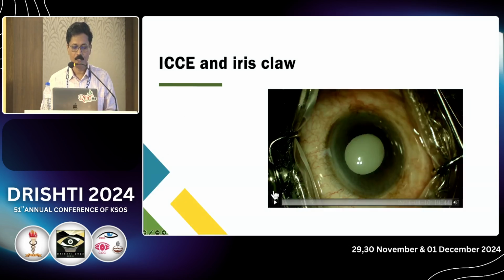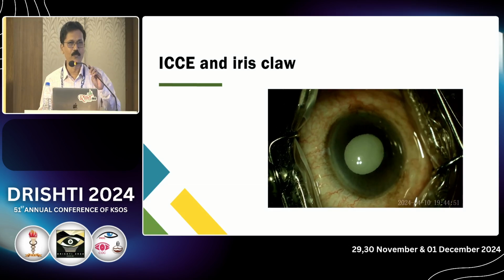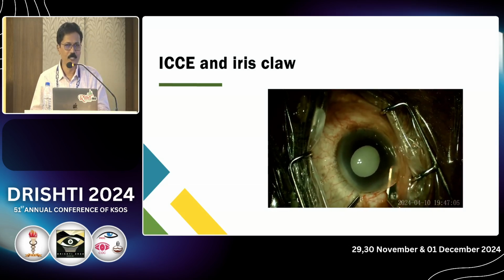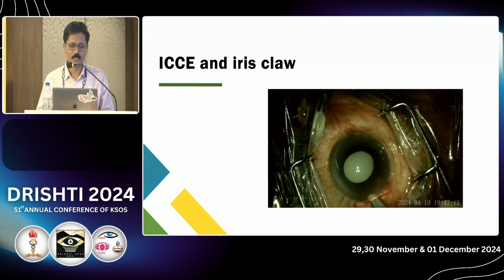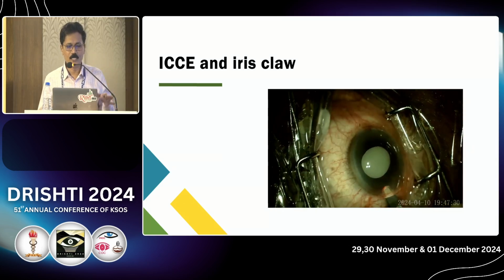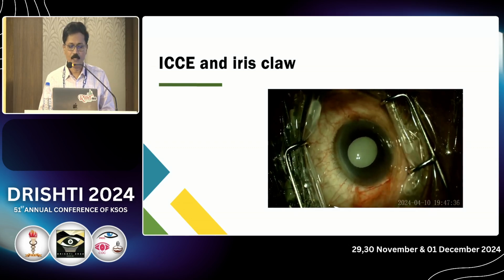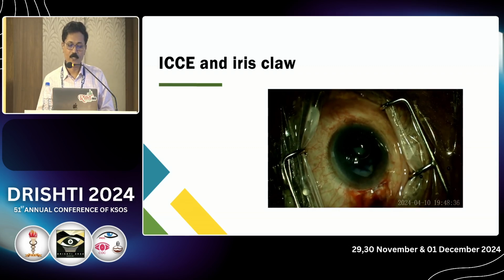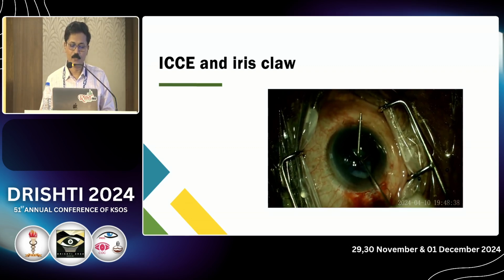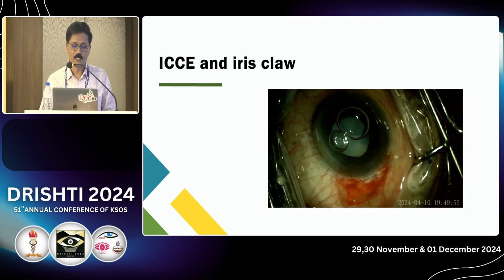Then in some cases, I think you should be prudent not to do phaco, because you cannot do phaco in all cases. In this case, preoperatively, it's a hypermature intumescent cataract again, but I thought that the AC was slightly irregular temporally. So because of that, I went in and did a scleral tunnel. After staining, when I was washing the Trypan blue, I saw a blob of vitreous in the wound. So there was a subluxation temporally.